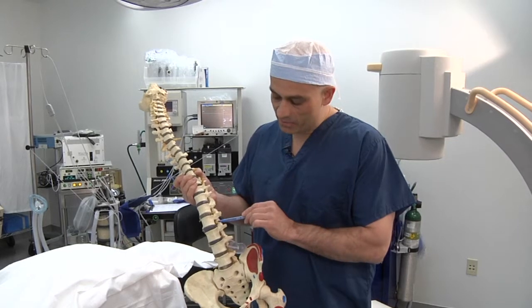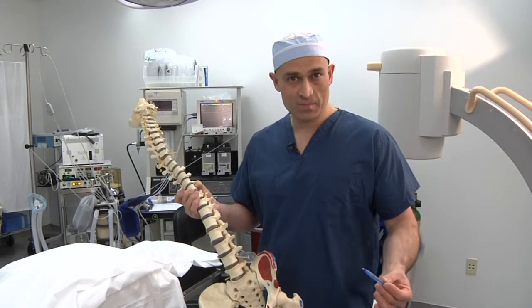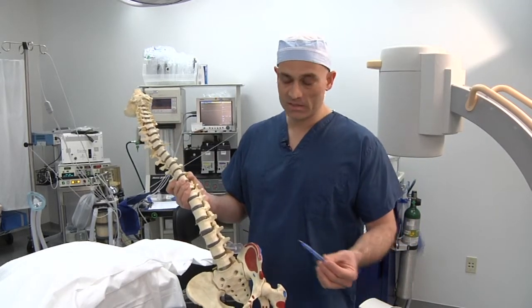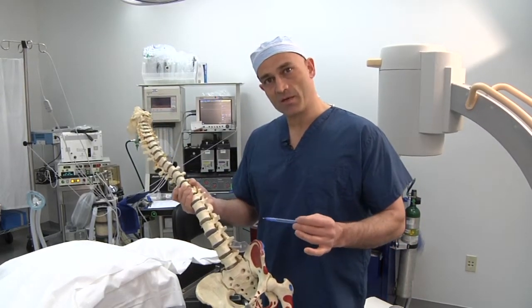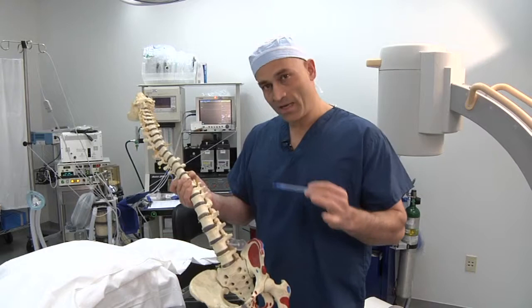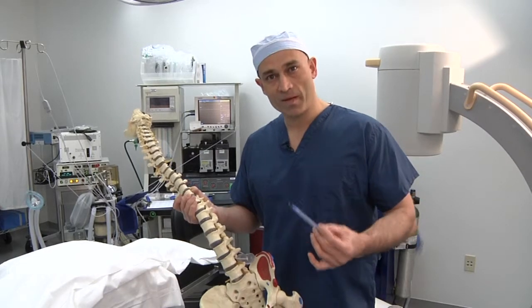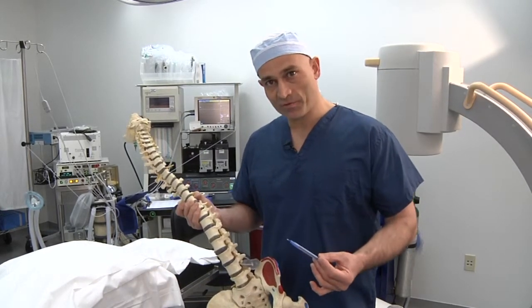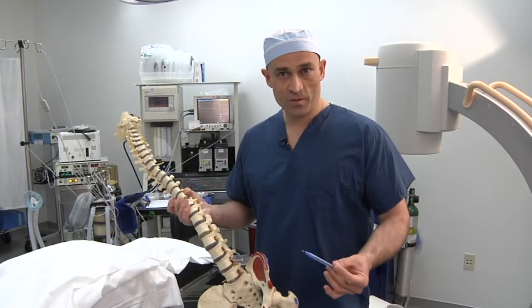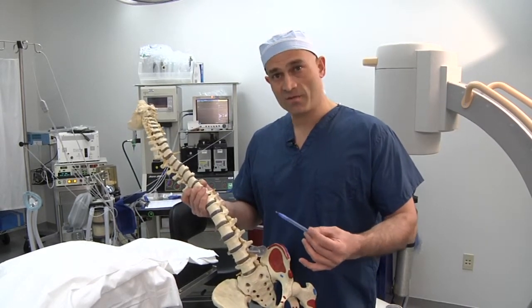It's the damage or the pinching of these nerves that leads to the symptoms that patients can experience. What we're going to do today is we're going to take a specialised needle called a radiofrequency needle and under x-ray guidance, we're going to place the needle just into the neuroforaminal space. We're going to heat the tip of the needle, and by doing so, this causes a destruction of some of the pain-carrying fibres which leads to an improvement in patient symptoms. This procedure is carried out with fluoroscopic guidance, which makes the procedure a lot safer and leads to a greater rate of effectiveness than if not carried out with that.